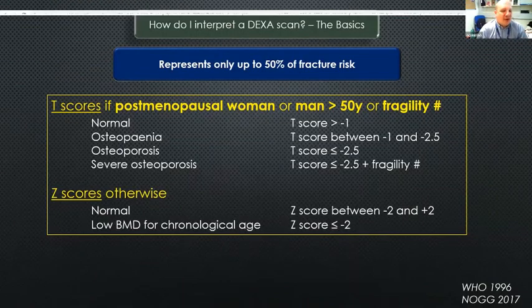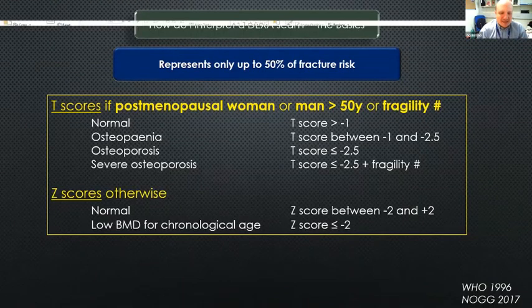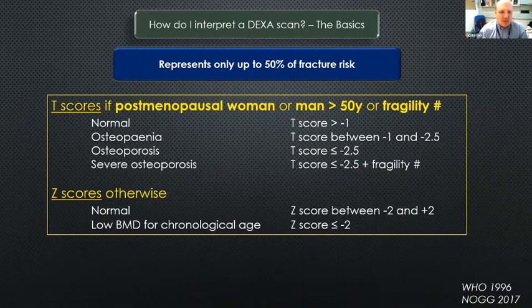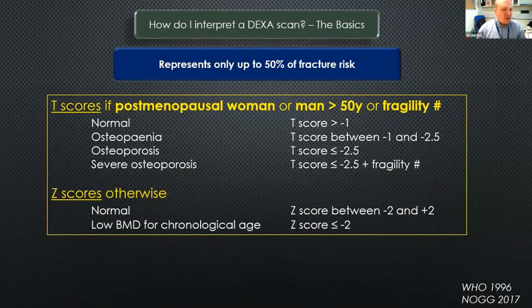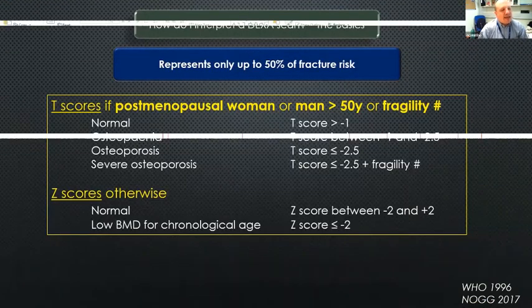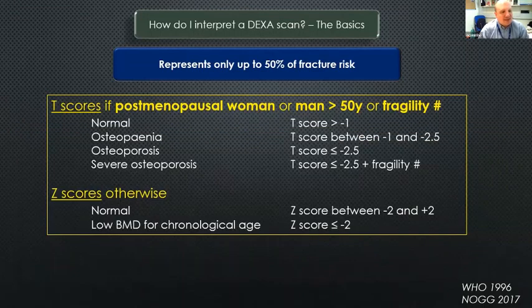So a severe osteoporosis is a T-score of less than -2.5 with a fragility fracture. The importance of this is that it means that low T-score does translate to fragile bone, okay? Because now you've got the clinical evidence that they fracture easily, so that means that T-score is even more important, okay? Then you've got the Z scores, which are age, sex and ethnicity matched.